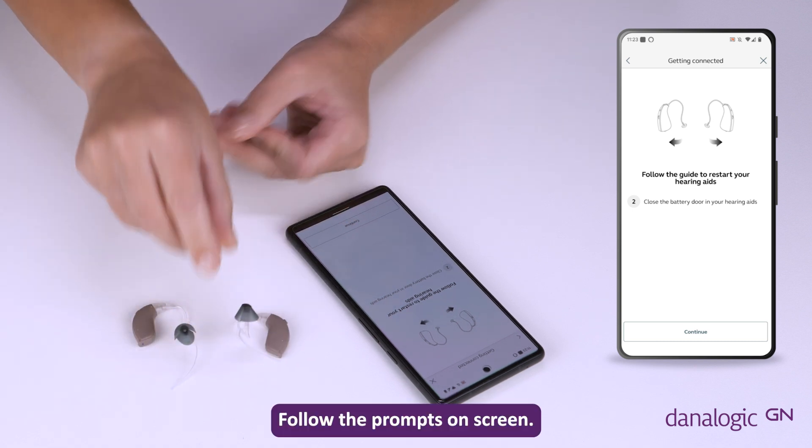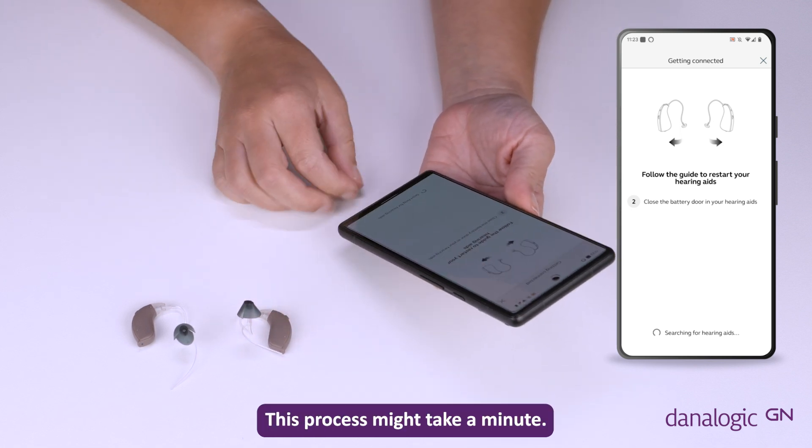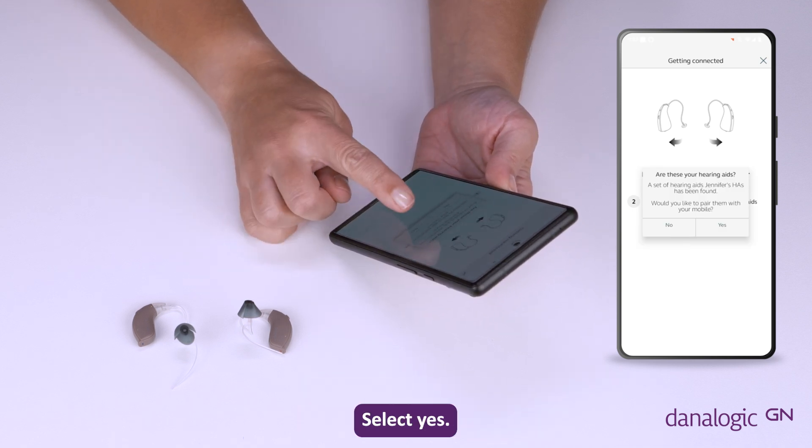Follow the prompts on screen. Please be patient whilst the app searches for the hearing aids — this process might take a minute. A pop-up will ask you if you would like to pair the found hearing aids. Select yes.